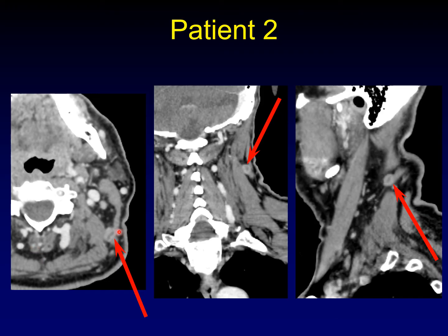Here's patient number two, and I'll give you both the coronal and sagittal reformats of that exact same node. In every single projection it looks the same — it's got a low-density center, and it's got an enhancing rim around the outside. This isn't some partial volume fooler; it really looks like that in every plane. This is a metastatic node with necrosis in the center, even though it's small.